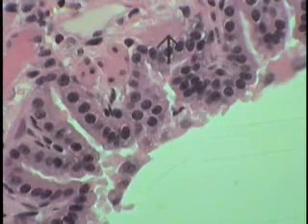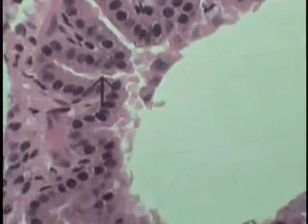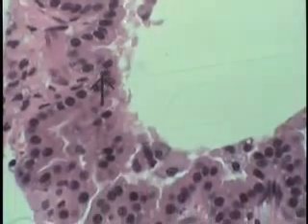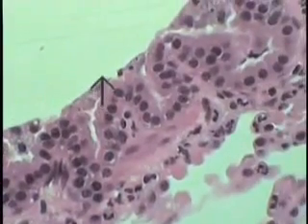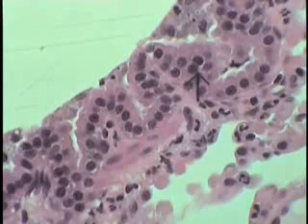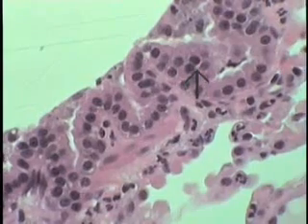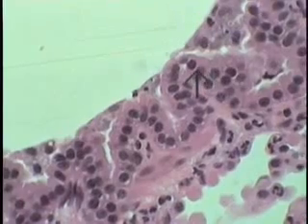Here's a couple more sections of smooth muscle as it has a spiraling course around the bronchial tree. And one can see it's a simple columnar epithelium getting lower in stature with very few, if any, goblet cells present. So we're down near the end of a typical bronchiole. The goblet cells will disappear and another cell will make its appearance, a Clara cell.